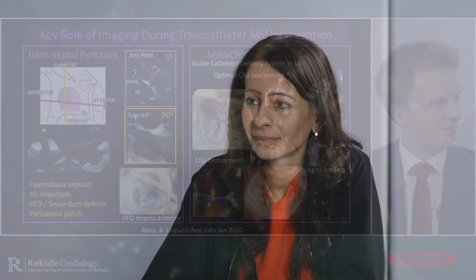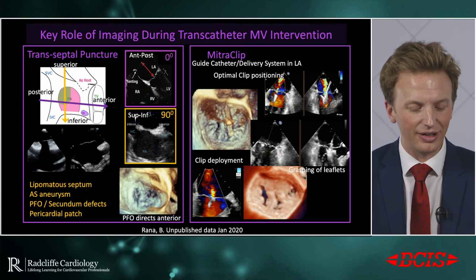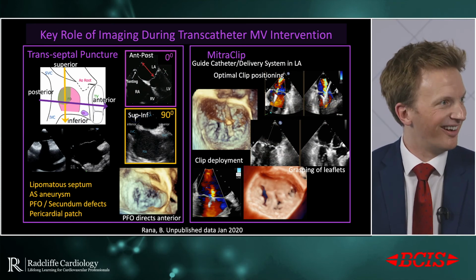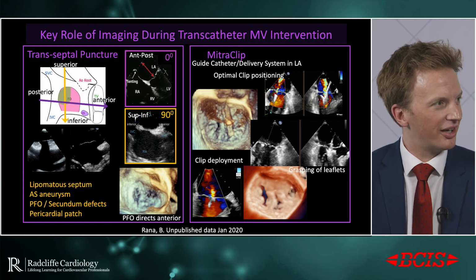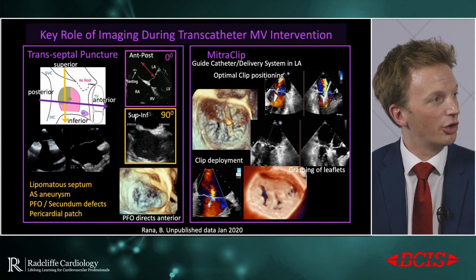Interventional imaging, as I'm sure Bushra will agree, is very different from diagnostic imaging. And the ability for the interventional cardiologist to communicate with the imaging cardiologist, to be very clear about what they're looking for, and then once the team have got used to working together, the one anticipates the other, and it becomes a very satisfying experience to be involved in. But it is different and it is complicated. And I think as interventional cardiologists, the important thing is that we're very clear about what we're asking for.